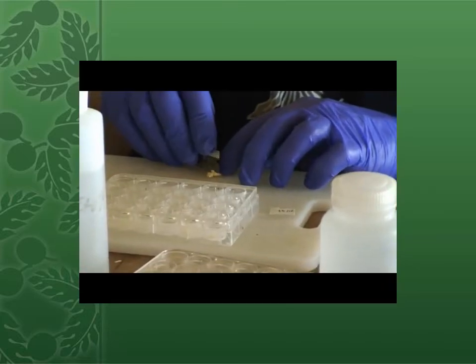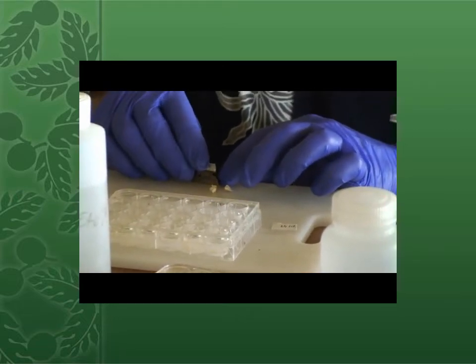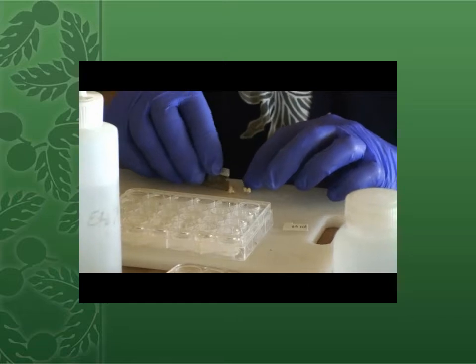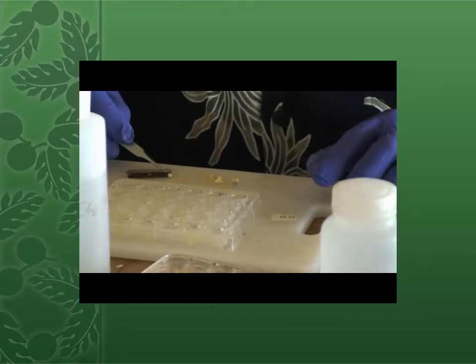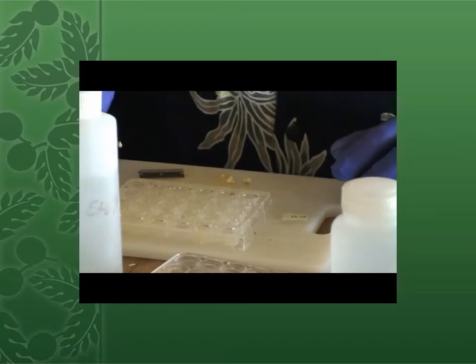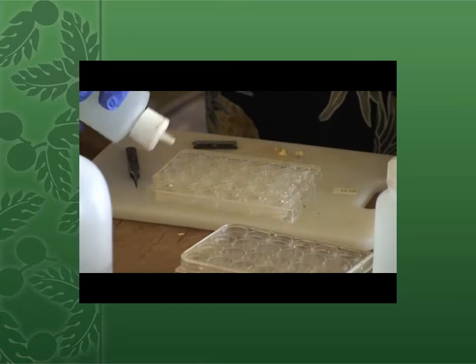Then you'll remove a small subsample of the gonad, no more than 2 millimeters in any one dimension. Put that subsample along with its tag into the well and then add some alcohol to begin the dehydration process.